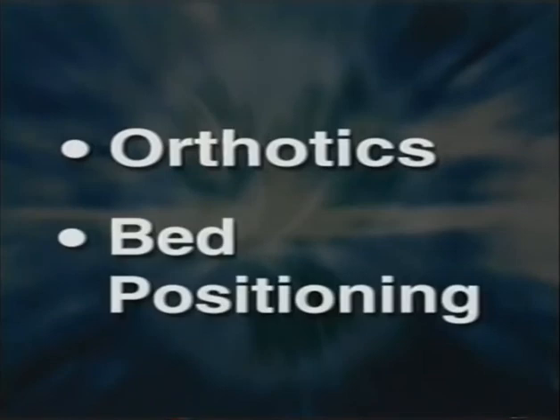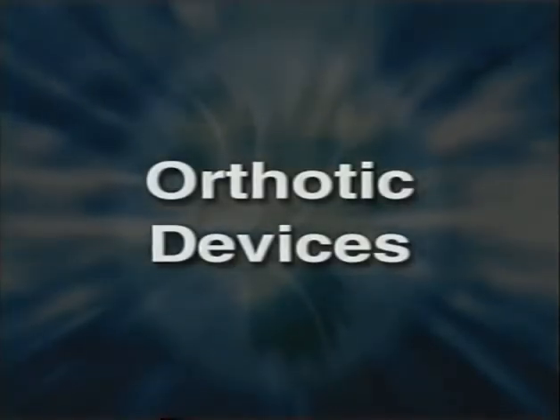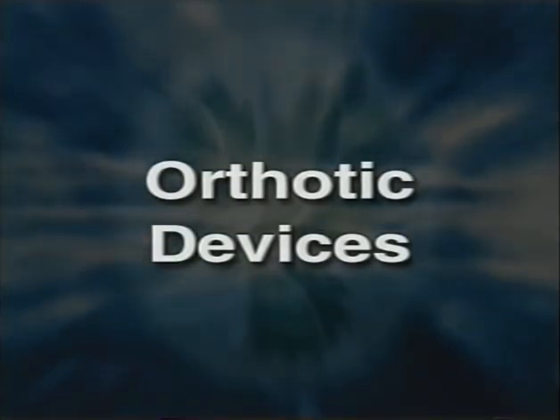This video will cover discussion and demonstration of the team approach to client therapy. They are orthotics and bed positioning. Following the video, you'll have a chance to practice applying orthotics and bed positioning during a lab session. The video can be stopped at the end of each section for questions or clarification. The definition of orthotics: mechanical devices used to hold a limb or joint in a certain position.